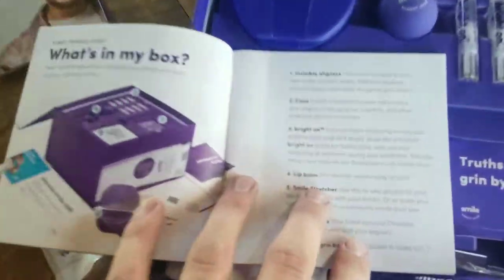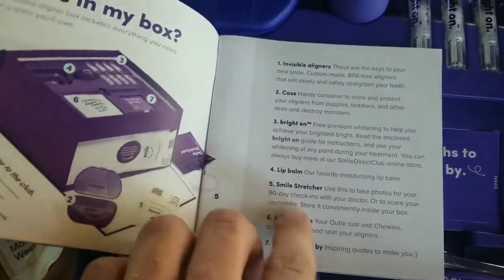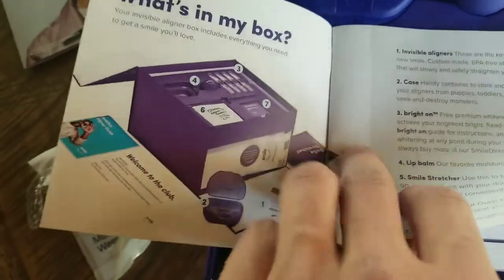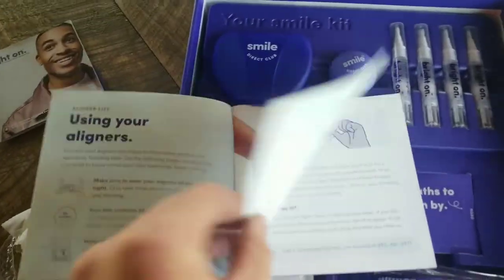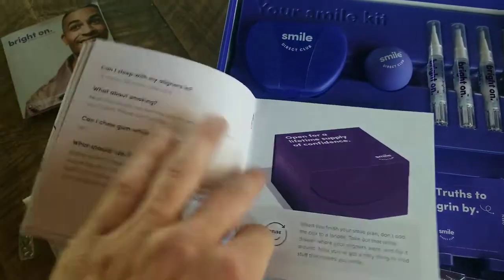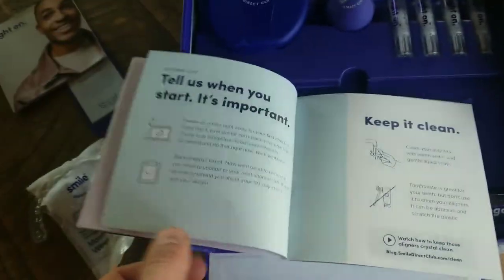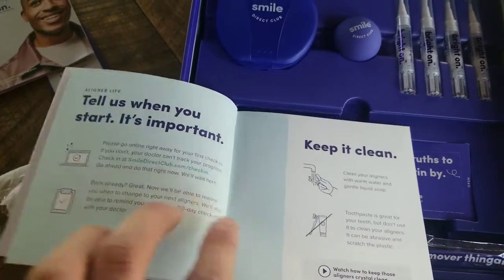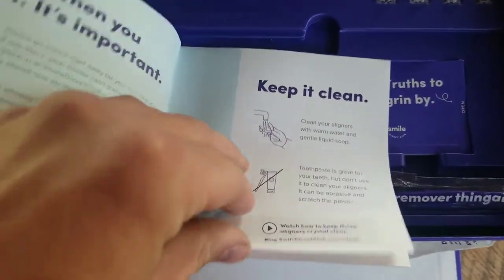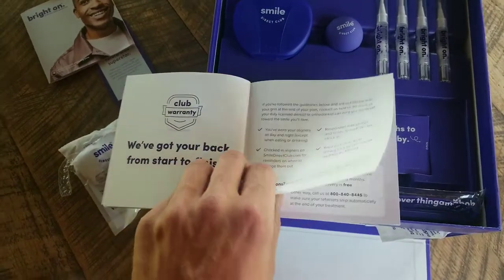What comes in the box: your visible aligners, a case, some whitening pens, lip balm, smile stretcher, aligner tools, and some inspirational quotes. It tells you how to use it and so on. There are random questions, you can reuse the box or recycle it. There's a link to go to tell them when you start, how to clean it, do's and don'ts, and your warranty stuff.